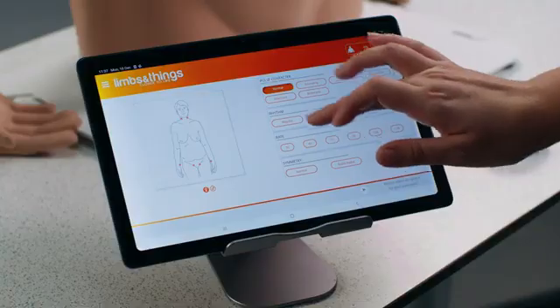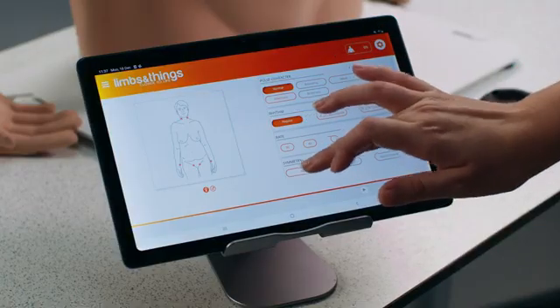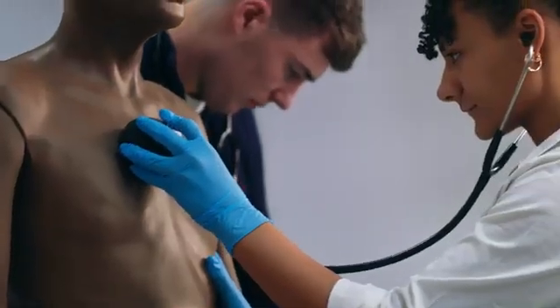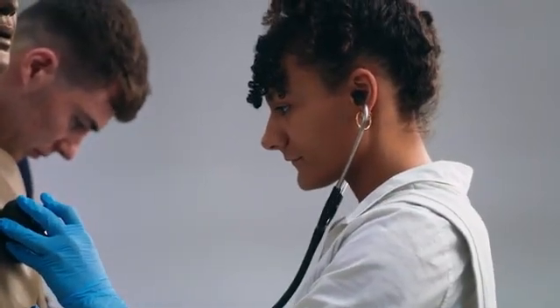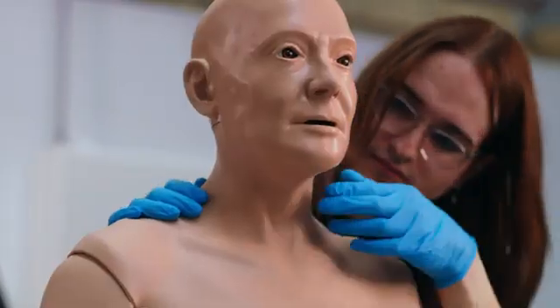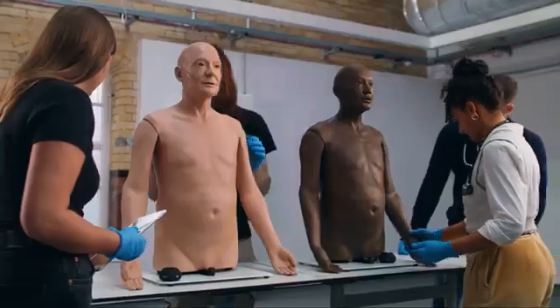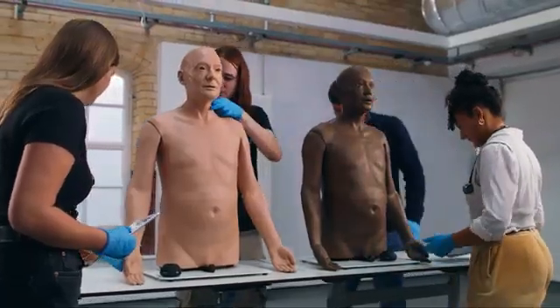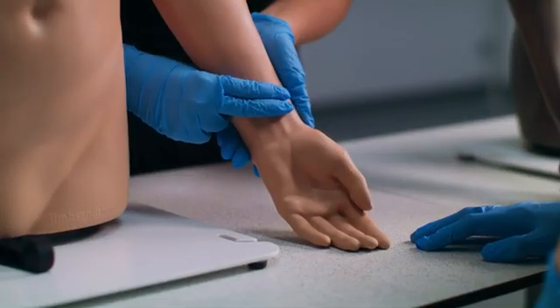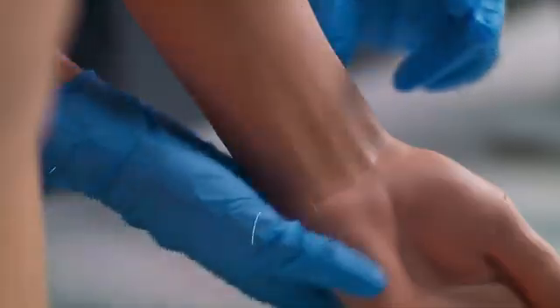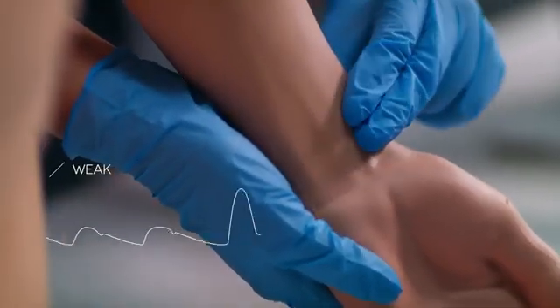The user interface allows training in individual skills and clinical cases with customizable lesson plans and assessments. The simple menu allows a wide range of cardiovascular palpation skills to be learned, including pulses with changeable rate, rhythm and character, allowing for easy side-by-side comparison of normal and abnormal.